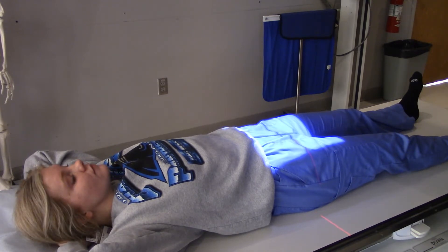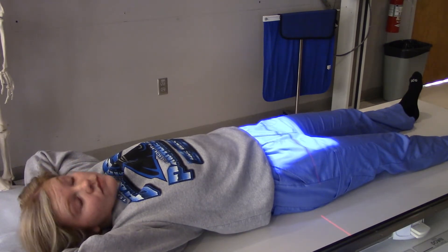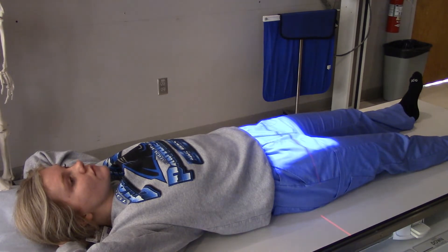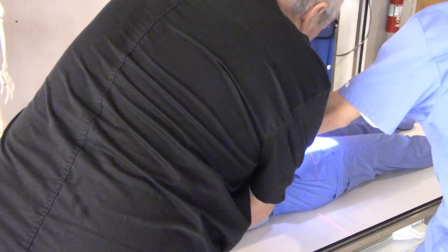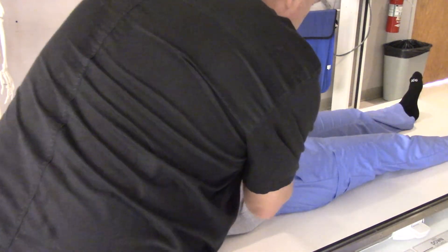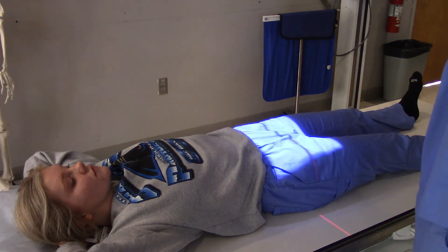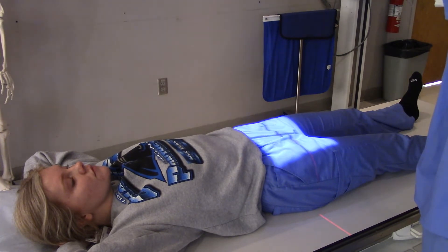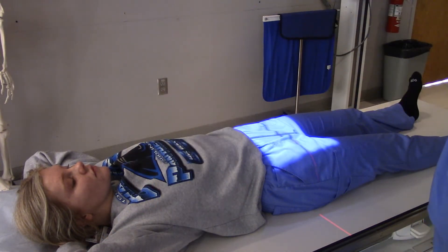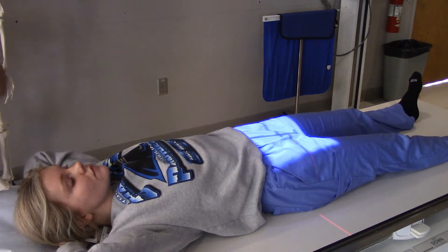That light field does not look correct. The automatic collimator is not working, so go ahead and just open it. My student's idea is to just increase the SID, which does work — and actually it's better for the patient. All right, let's turn off the automatic collimator since it's not working.